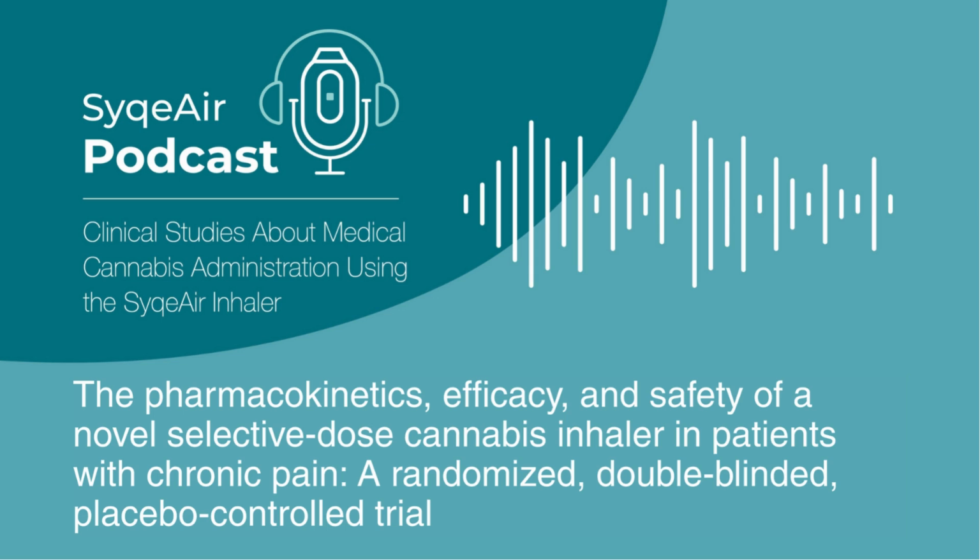So wrapping up this deep dive on the SyqeAir Inhaler study, the core takeaway seems to be that delivering these very low metered doses of THC via this specific device was shown here to be safe and effective for reducing pain in chronic pain patients. And critically, it suggests a path towards potentially much, much lower overall cannabis consumption compared to current typical methods by leveraging consistent and uniform delivery. The real innovation seems to be that consistent low-dose delivery capability. That's what could enable predictable effects, true individualization of treatment, and maybe bring medical cannabis more into line with pharmaceutical standards. It definitely pushes things in that direction.